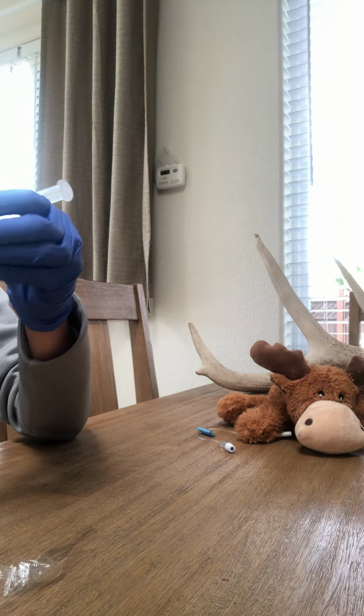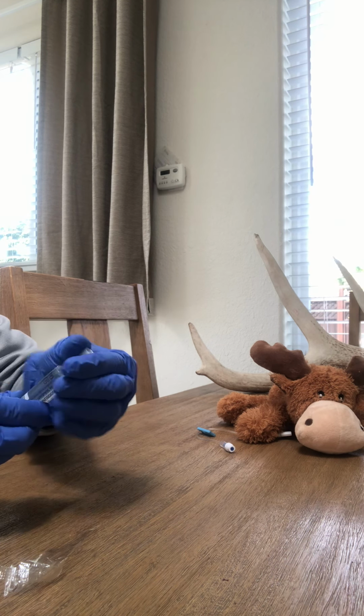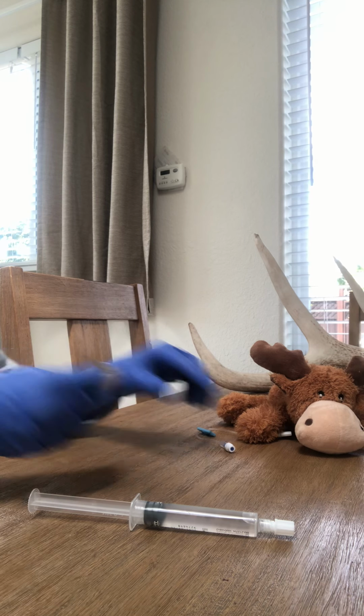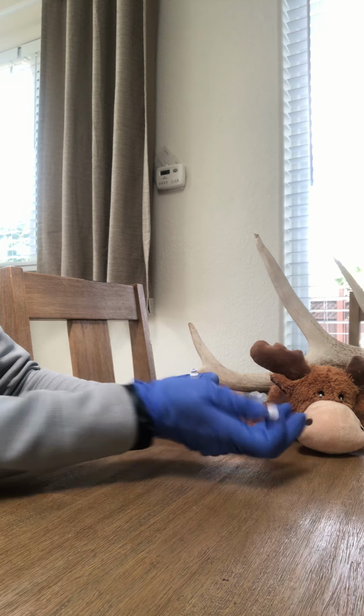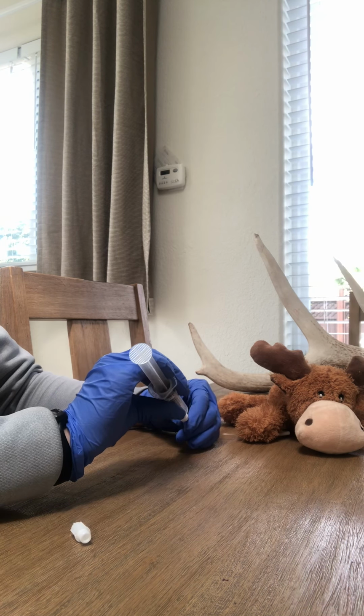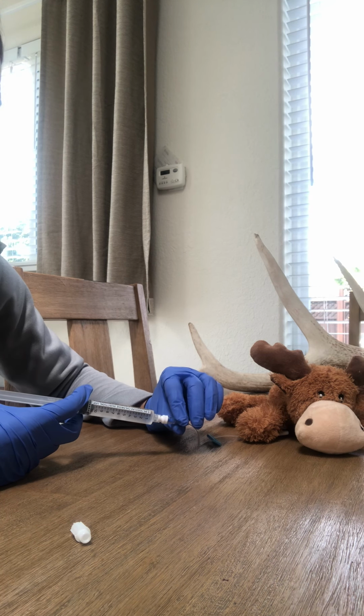Okay. Here's my saline. Okay, so I'm going to cleanse it again. Let it dry. Now it's sterile. And take my saline and I'm going to attach it here. And then I'm going to be pushing 5 mLs.